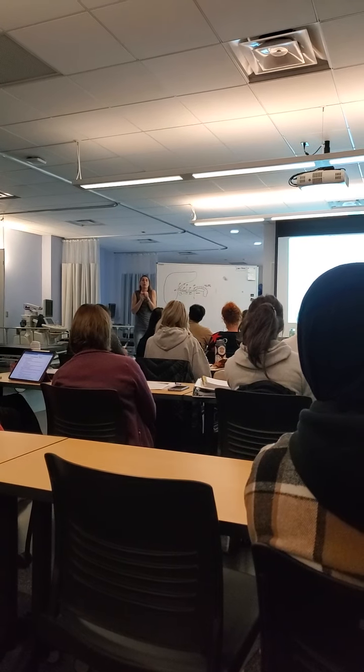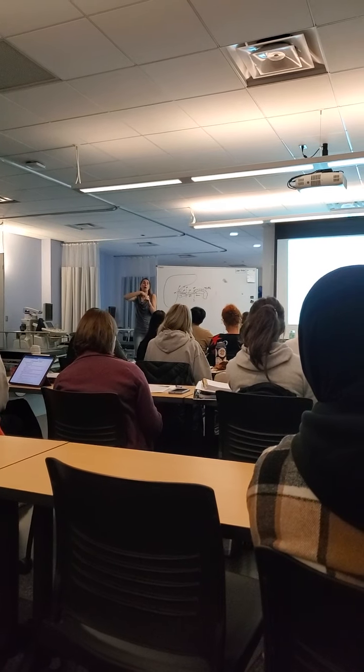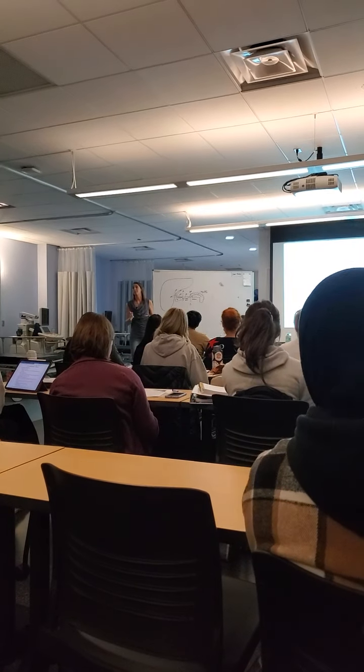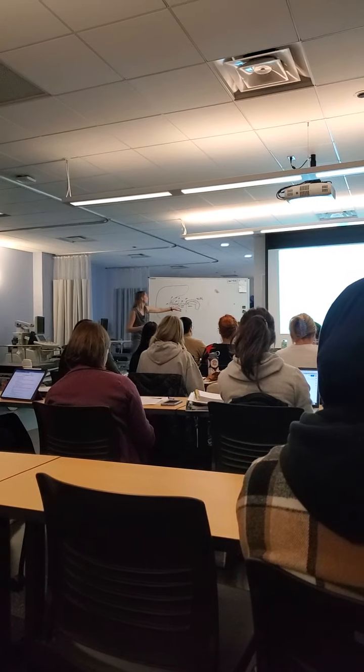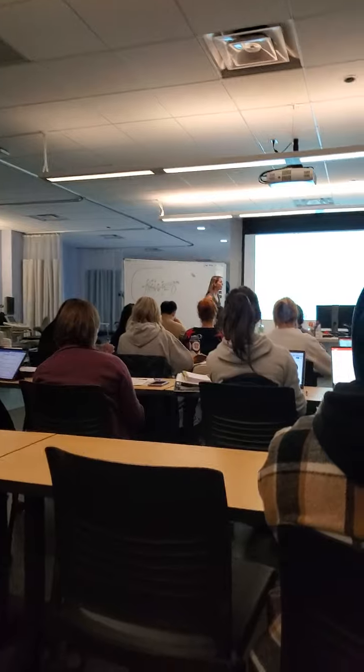And the sphincter of Oddi is going to relax and allow pancreatic juices as well as bile from the common bile duct into the duodenum. So these guys are really good friends right at this panc head. Okay, so let's kind of look at what this looks like.